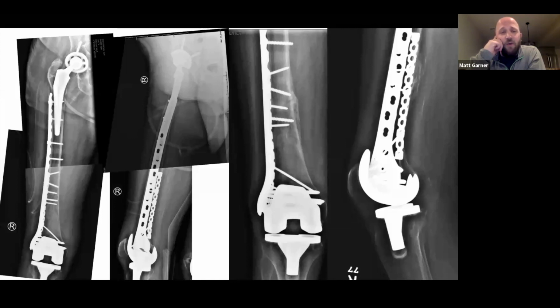I see a long spiral oblique in an interprosthetic fracture, and the first thing I think of is anatomic reduction and an antiglide plate. So that posterior lateral plate is an antiglide plate, a buttress plate, whatever you want to call it, at the posterior lateral extent of that oblique fracture, which I think gives you a tremendous amount of stability. Dave Helfet calls that a plate as a clamp. So you use that for your preliminary reduction and you lag through it. And then your lateral condylar plate is a little more robust, but serves primarily as a neutralization plate.